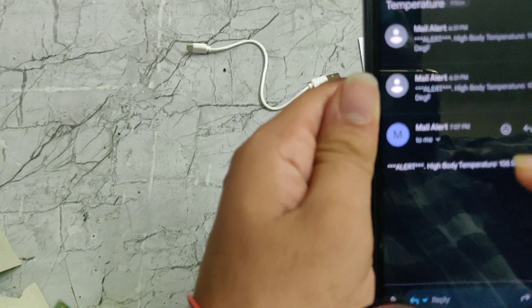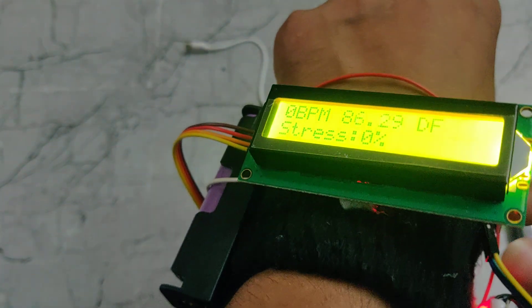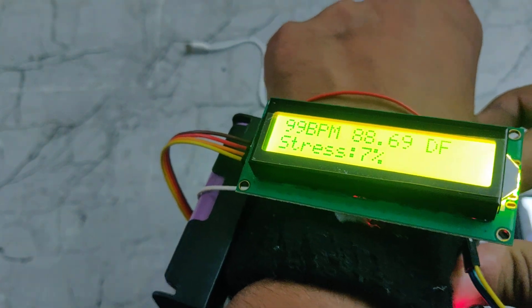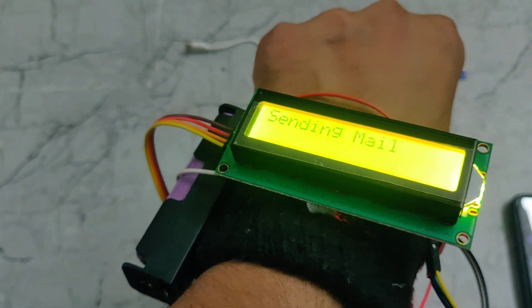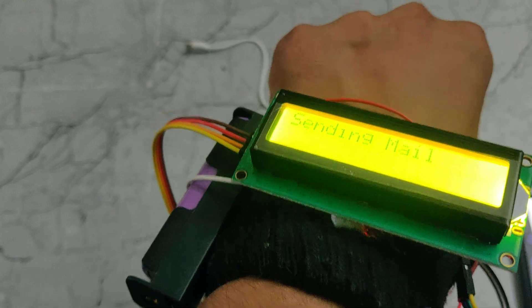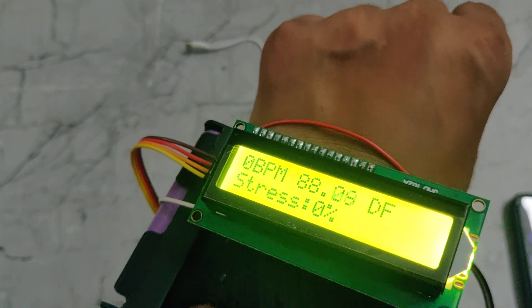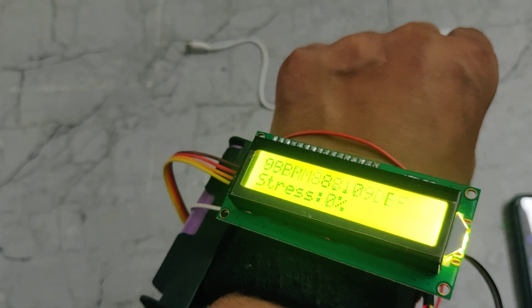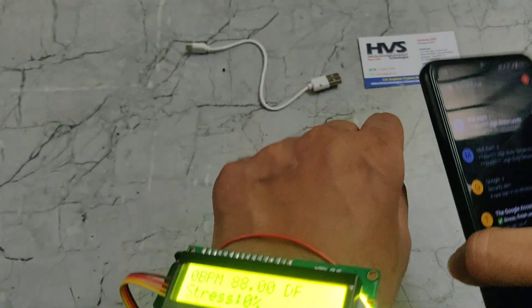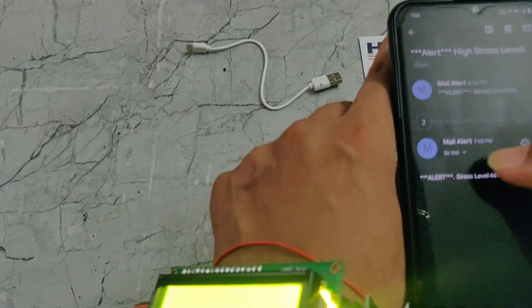These are the previous messages from testing. If the stress level is more than 30, then it will send a message. If we interact with the device here, we can see the stress level will increase. Now we can see it is sending a high stress level alert. Here is the high stress level message, and this is the previous message.